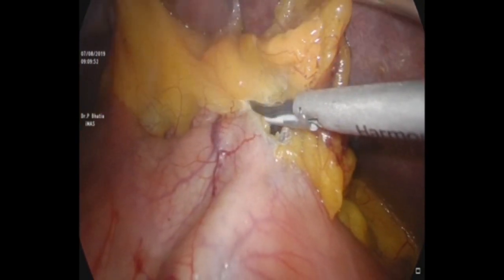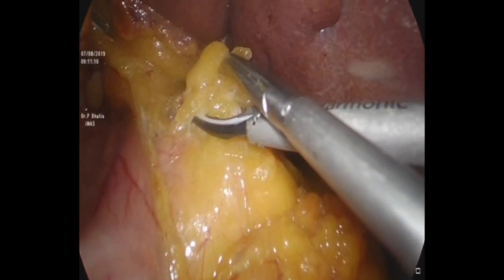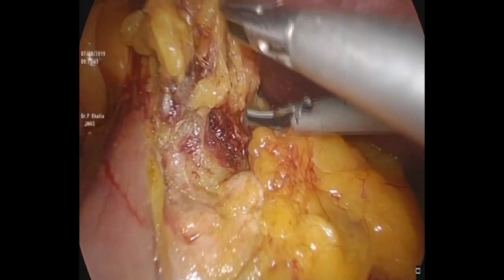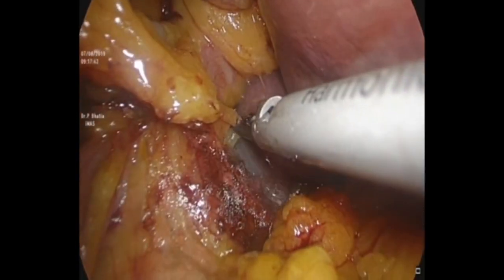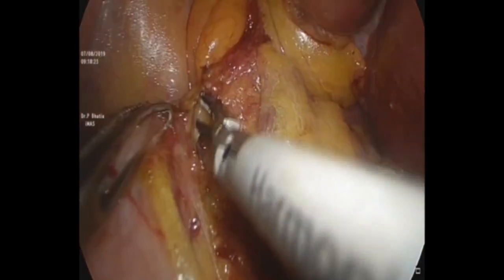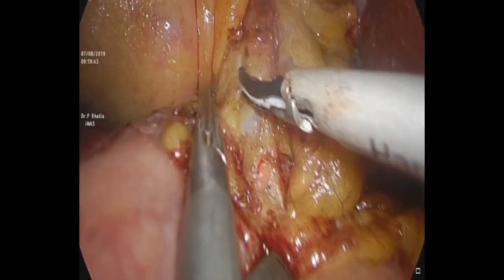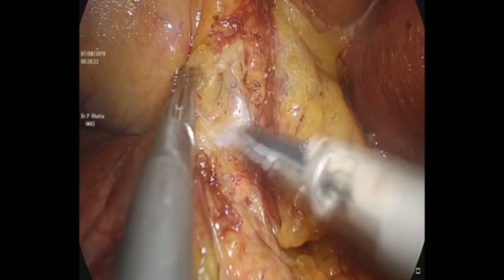This instrument can be used as a Maryland dissector and it can also handle bigger vessels. We start with the aim that all the fibro-fatty tissue in the hepatoduodenal ligament will be taken off en bloc — meaning all the fibro-fatty tissue with all the lymph nodes: pericholedochal, periportal, and periarterial. All these lymph nodes and fibro-fatty tissue have to be taken en bloc rather than piecemeal.